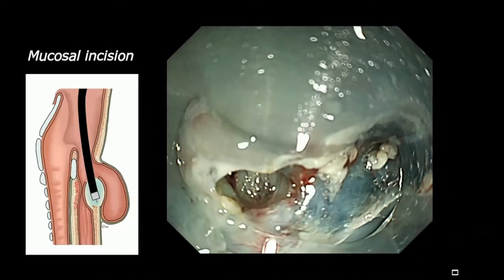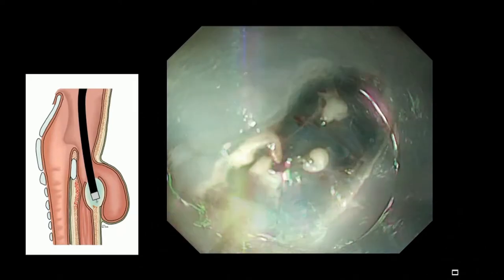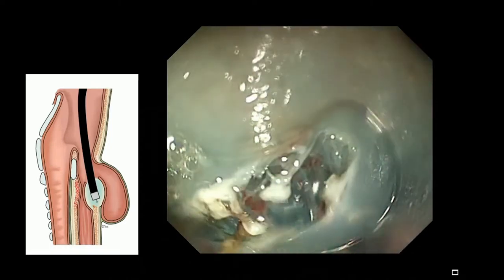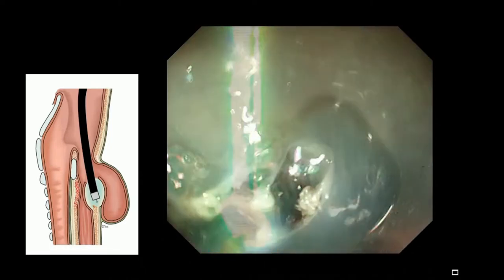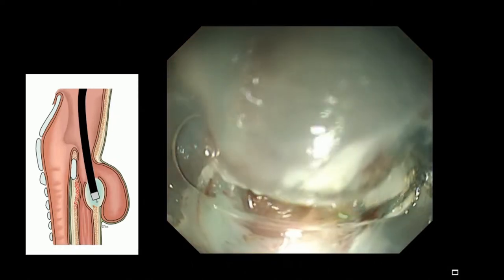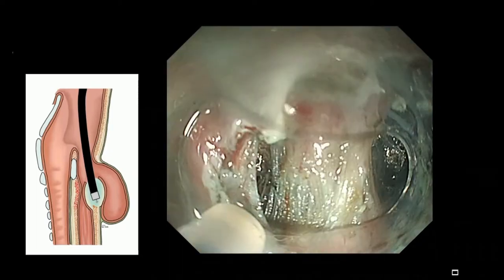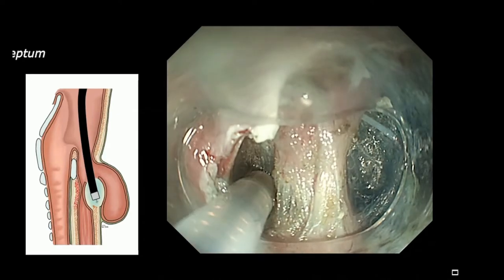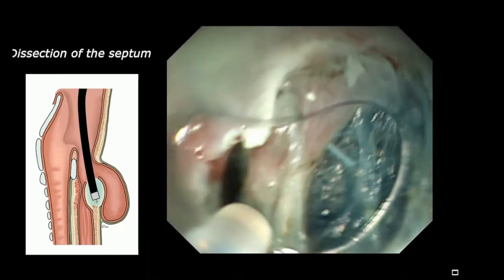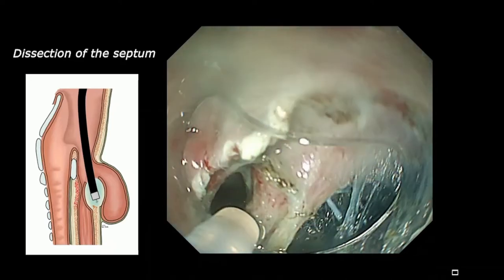Previously it used to be conventional mucosal and muscle layer cut together — we widely dissected mucosa together with the muscle layer. But in this procedure, it's like a POEM or ESD procedure. First we dissect the submucosa only. Now in front of us we can recognize the muscle layer. On the left side, the diverticulum side, we inject into the submucosal layer to make a contrast.